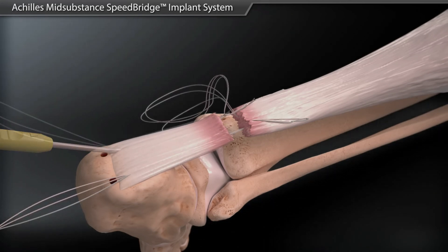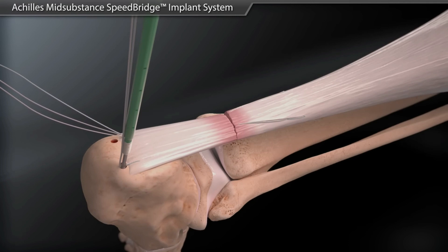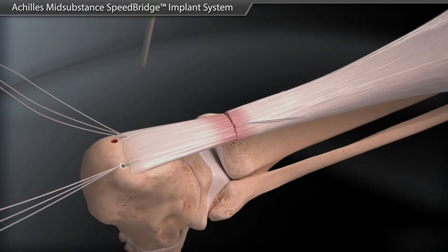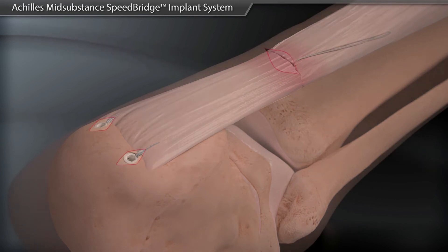The sutures are placed in the 4.75 mm swivel lock. The foot is plantar flexed to approximate the tendon ends and the anchor is placed in the prepared hole to secure the suture. The same steps are repeated for the sutures on the other side, and the result is a secure knotless repair of the tendon rupture.